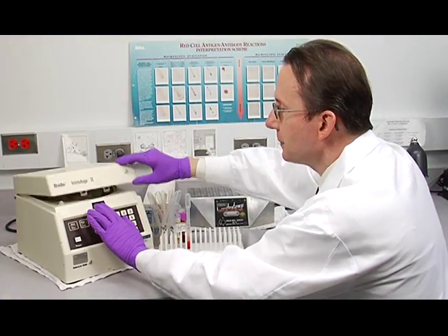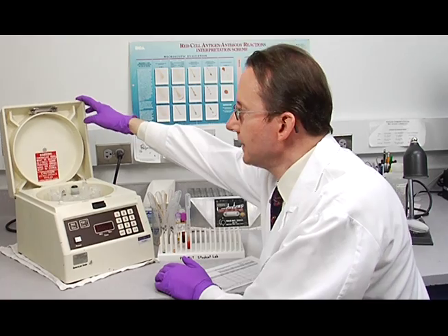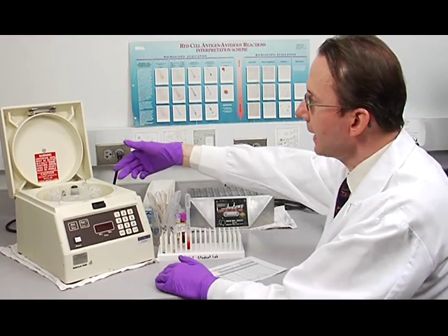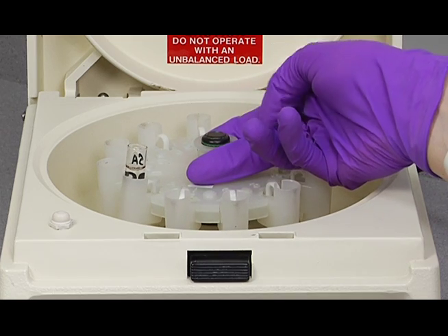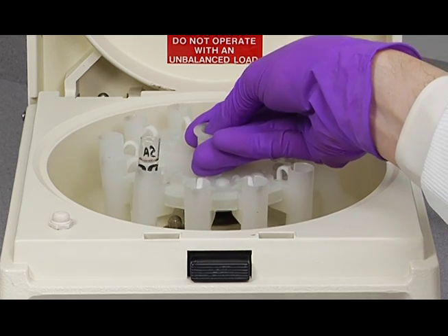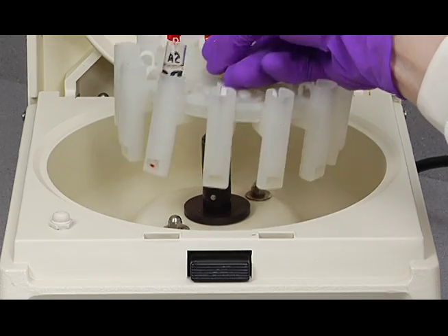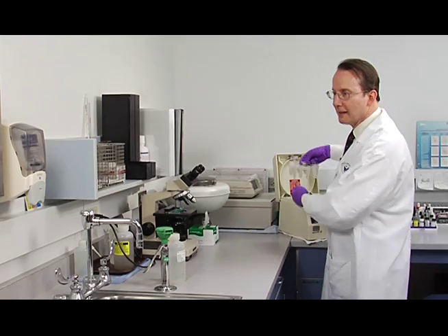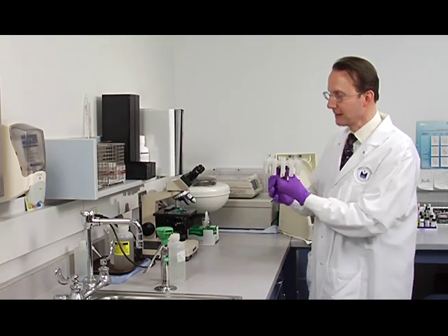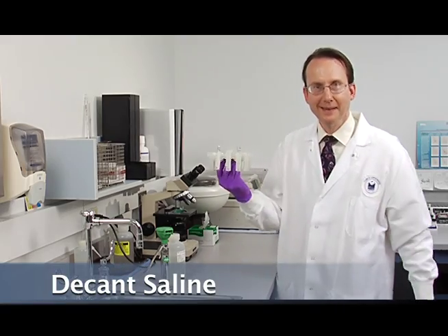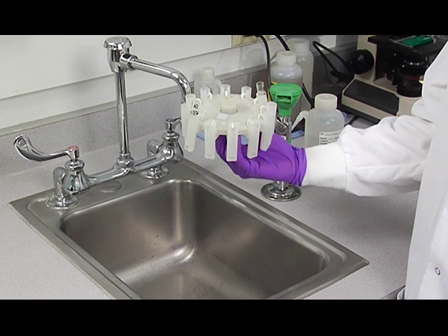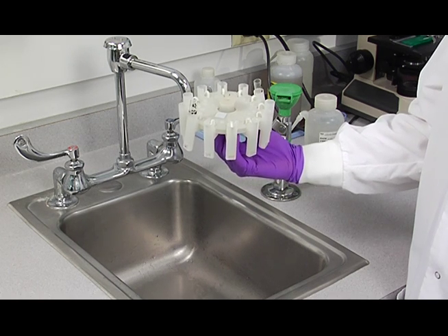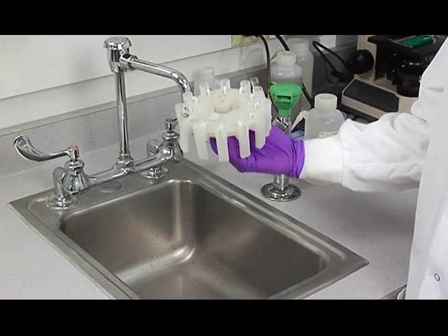So after they've spun down for 60 seconds, you can take the head out of the centrifuge. Put your fingers under the flange here and push down on the shaft. Bring it out like this. Then take the tubes over to the sink to decant the saline. And you're going to hold the tubes right here and just invert the tubes. Let the saline run out. No shaking.